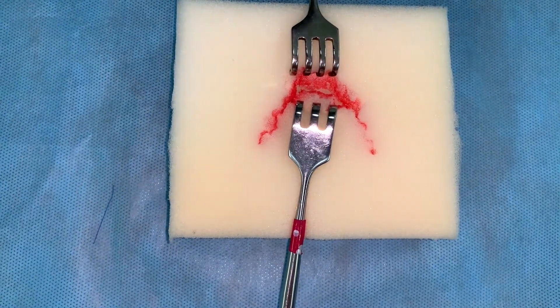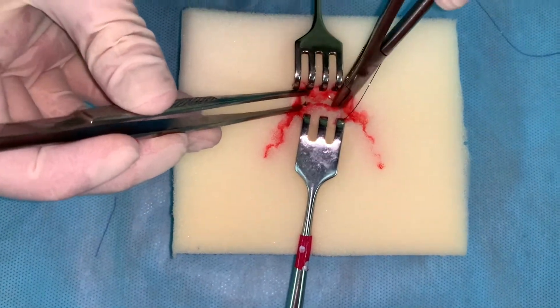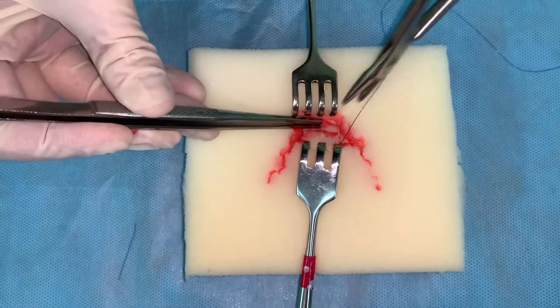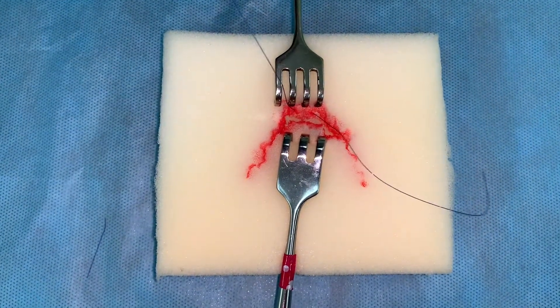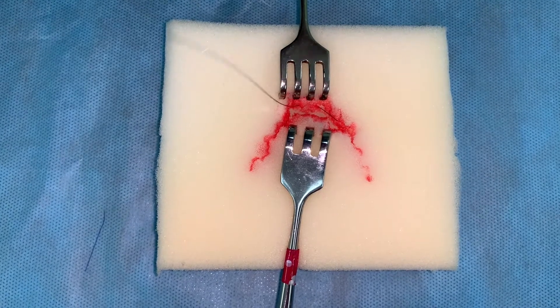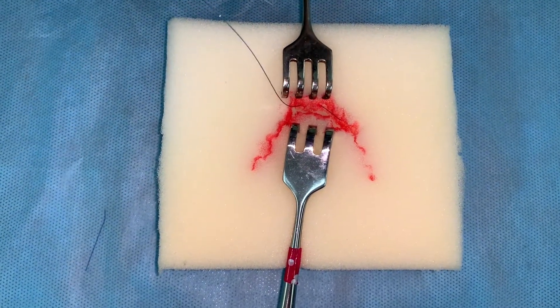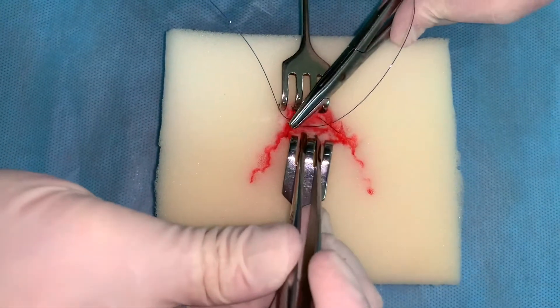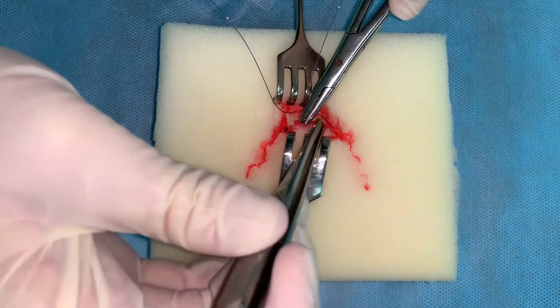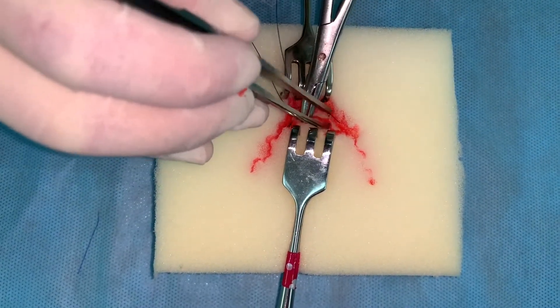Wound closure is performed layer by layer, starting from the depths. By means of the needle holder, squeezing the needle with suture and making a prick in and out at the same distance from the edge and depths of the wound, perpendicularly to the wound line. Deep layers — muscles, fascia, cutaneous cellular tissue — are closed with dissolving materials, for example, vicryl. Suture is cut down to the base of the knot.